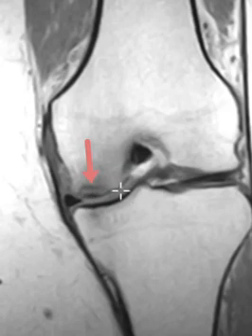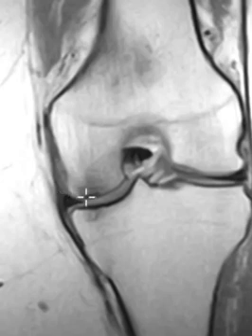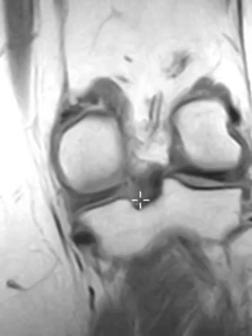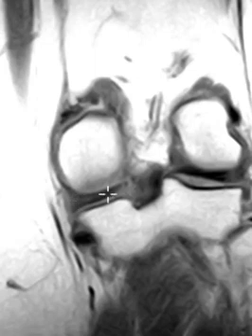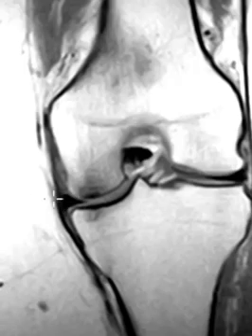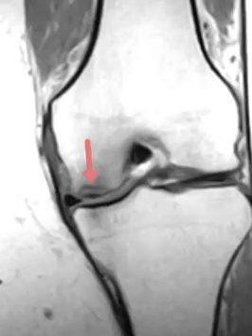Luckily the bone is not collapsed yet. We should always look at the very back of the meniscus, because the meniscus adds support — it causes this part of the femur and this part of the tibia to weight bear together. When it's not working, there's too much pressure. Looking toward the back, we can see the posterior part of the meniscus. In this region, this is the meniscus root. Instead of seeing a nice horizontal black line attaching, we see bright bands — this is a tear through the meniscus root. The meniscus root tore, and now the meniscus is just drifting out laterally — or medially rather — it's not doing its job, and because it's not doing its job there's too much stress here. This is a typical example of a stress fracture.